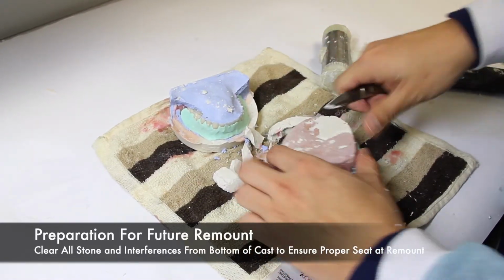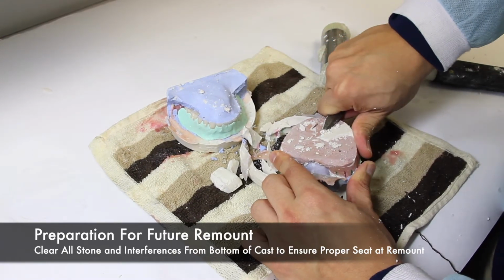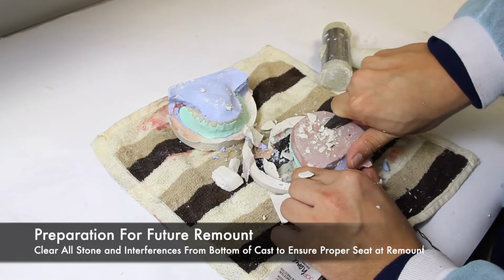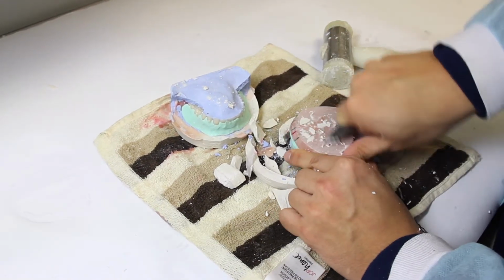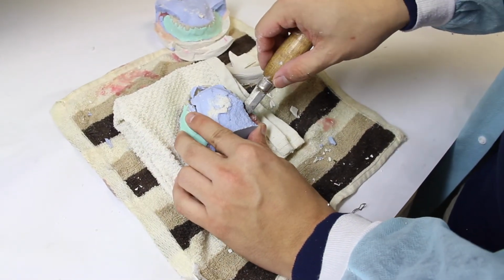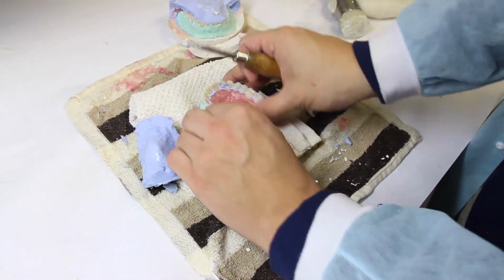Remember, no matter the technique, the stone should be cleared off of the base of the model. This is done in preparation for the future remount procedure. As long as there are no major undercuts in the palatal area, the investment stone can be removed with ease using a plaster knife.